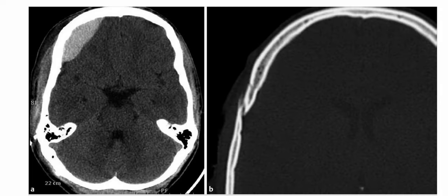So this is the case of a young patient who has presented after a motor vehicle accident. This is the axial CT scan, and it shows a lenticular biconvex hyperdense extra-axial hemorrhage with mass effect on the underlying right frontal lobe, as well as the superficial scalp hematoma with soft tissue swelling. This hemorrhage is confined by the coronal suture.